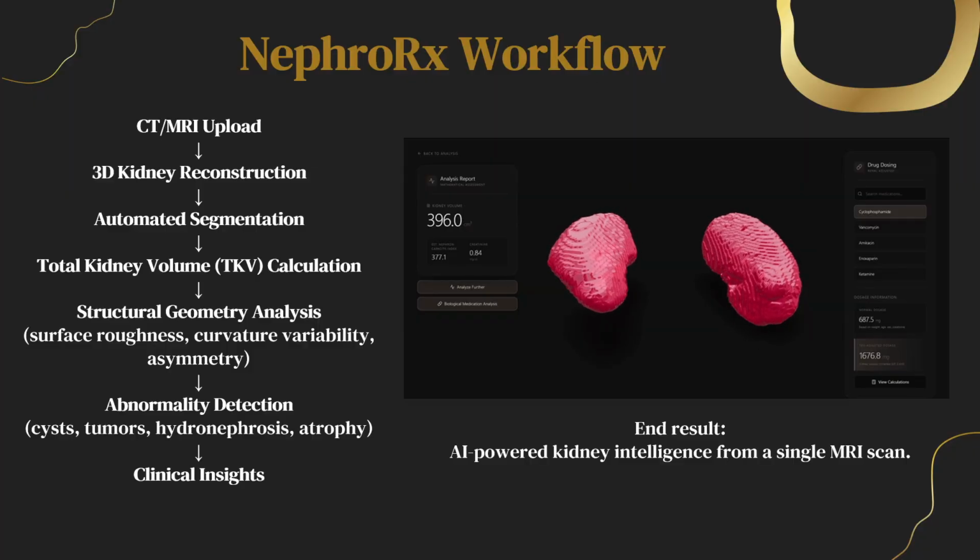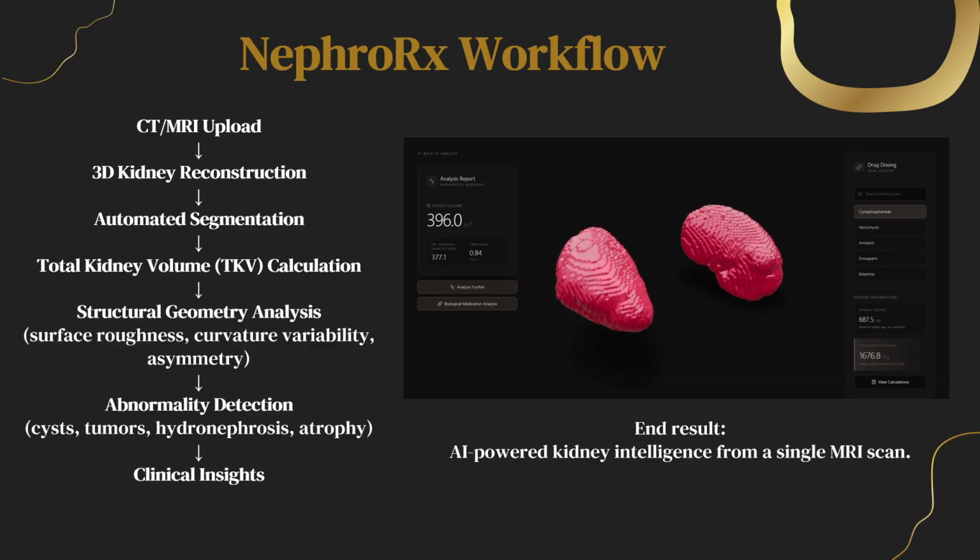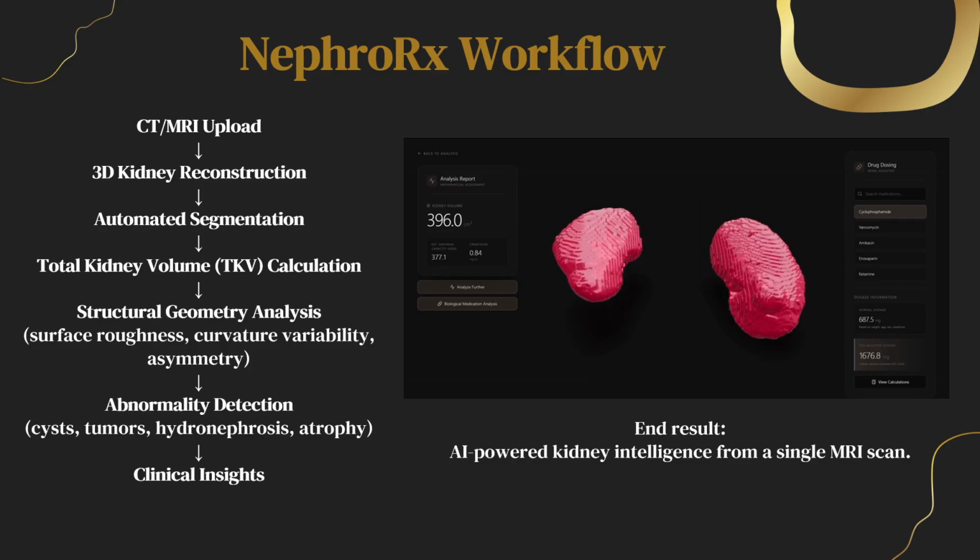We also screen for abnormalities, including cysts, tumors, hydronephrosis, and signs of atrophy. This information can present a whole number of different clinical insights, which we'll show you live in just a second. Now, let's hop into our demo.